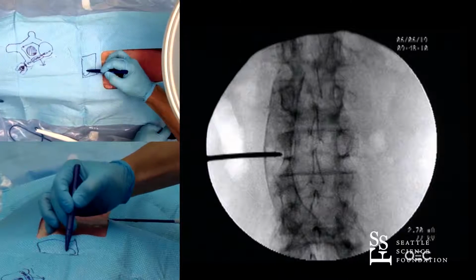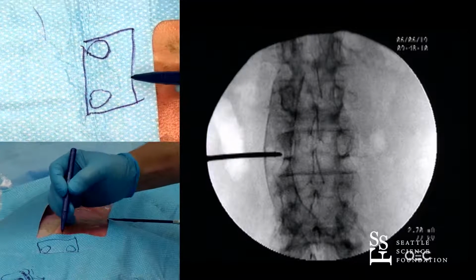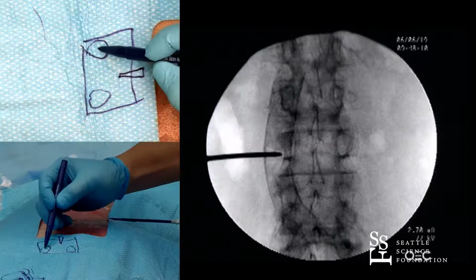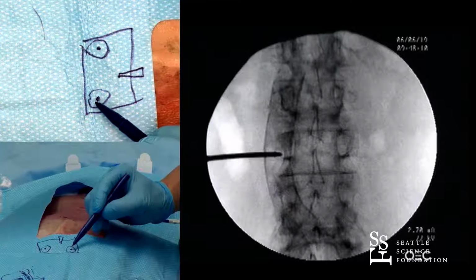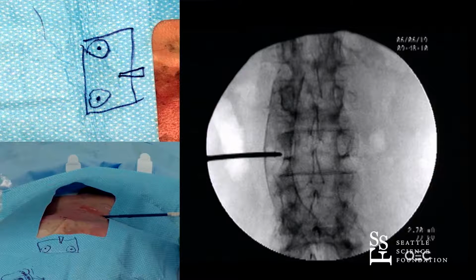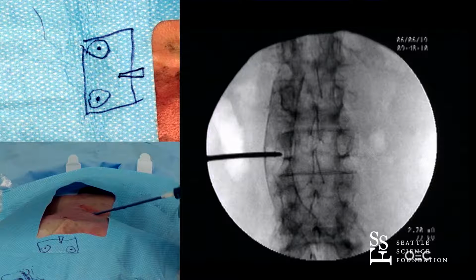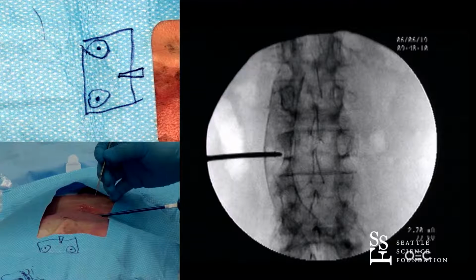We're going to see two circles, and this is almost like a video game. Here's the spinous process, and this is our target point. We really want to go in there, and that's going to lead us to the canal. And instead of doing this under an open system, we're going to do it percutaneously, so we don't really have to dissect the spine. So there's the mark.